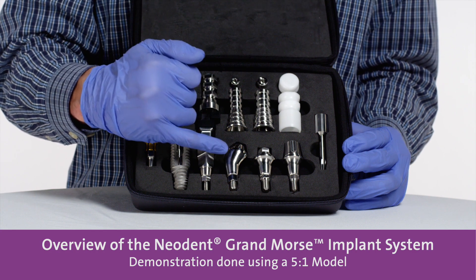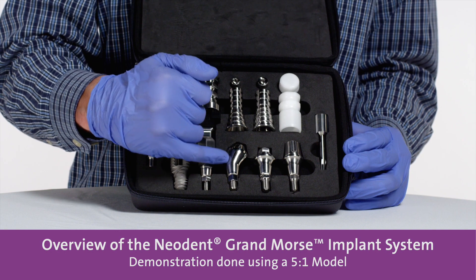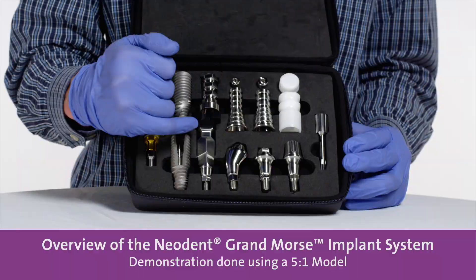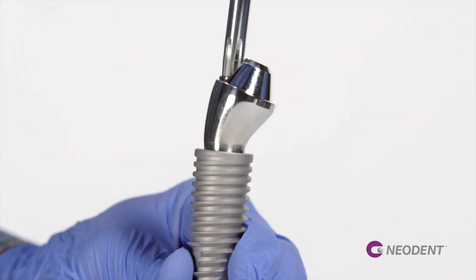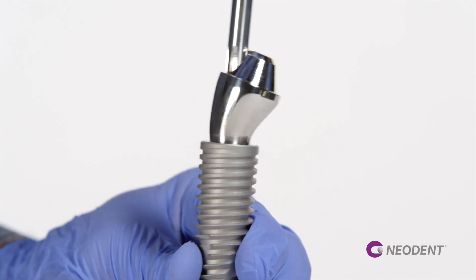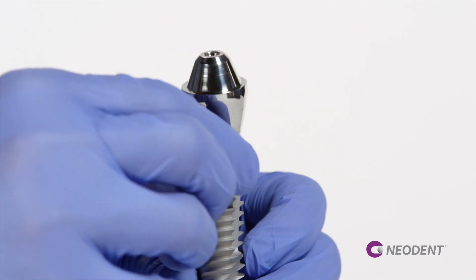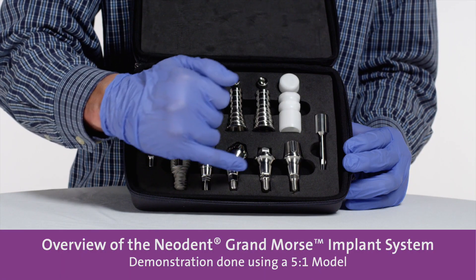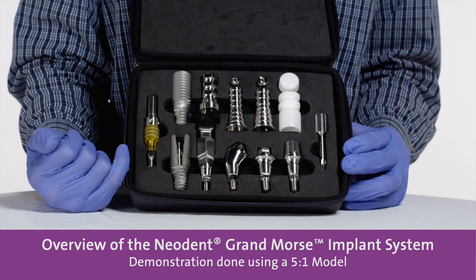We have the angle mini conical abutment 17 degrees. It's easier to show the doctor how smooth this new design is. The same new driver that we use to put the occlusal screw, you can torque this abutment down. The recommended torque is 20 newtons. And also in all these three or four abutments, we have the engagement very solid.